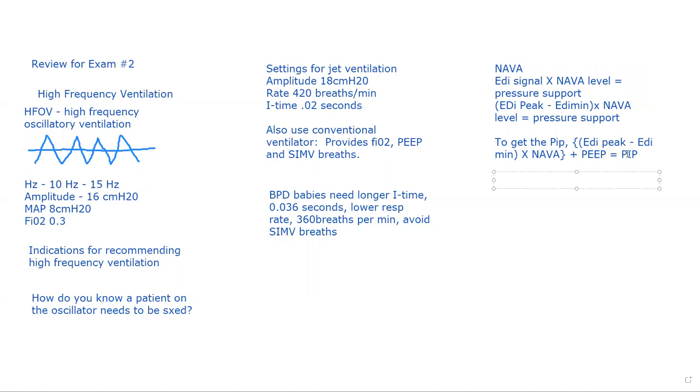So if you have a patient on NAVA, you can use it non-invasively as well as invasively. If you're just using NAVA support and giving the patient pressure support breaths, that's one way of delivering NAVA. Another way is to be monitoring their work of breathing during other modes of ventilation. So you could have a patient in PRVC and have NAVA on the patient, and it would just be monitoring their work of breathing while they're in other modes.